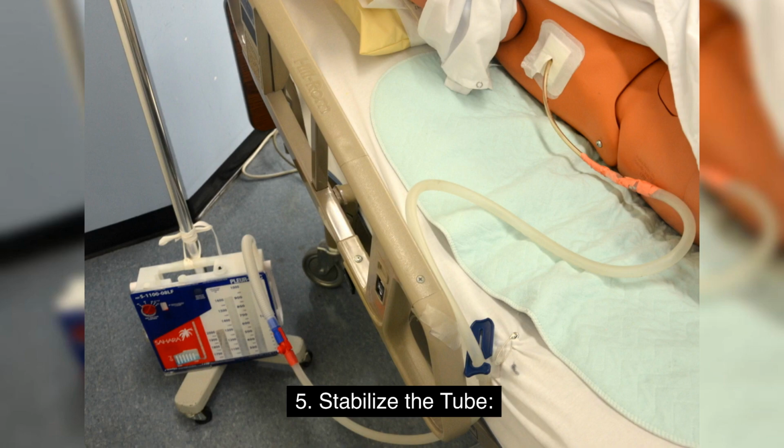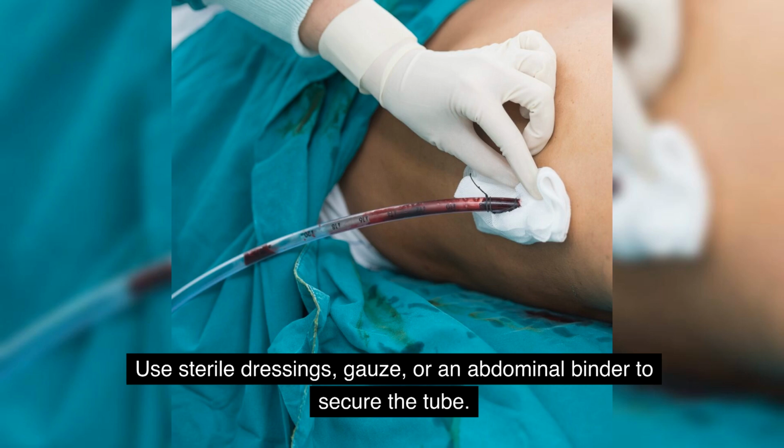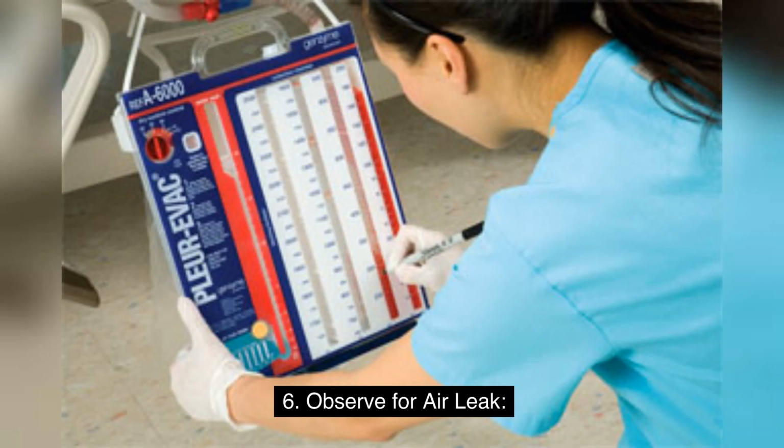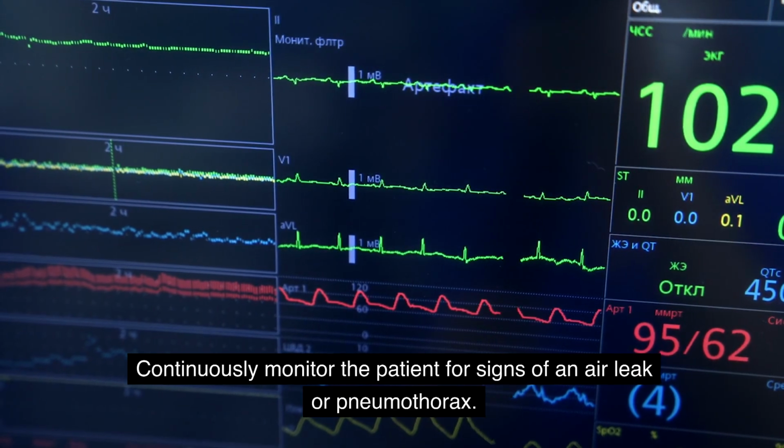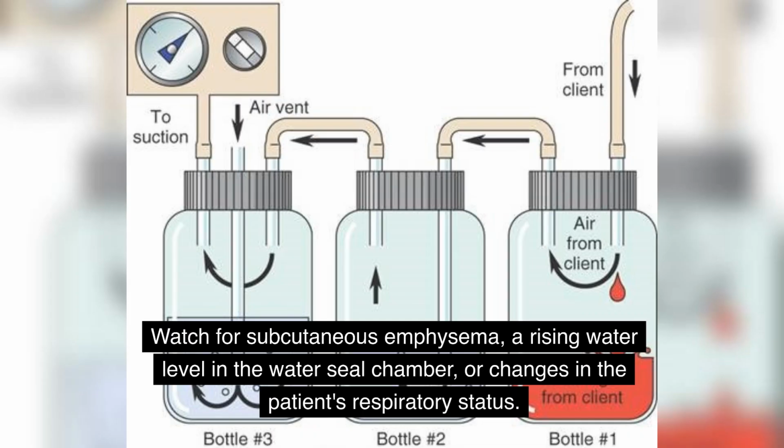5. Stabilize the tube. If the chest tube is still partially in place and not completely removed, gently secure it to prevent further dislodgement or movement. Use sterile dressings, gauze, or an abdominal binder to secure the tube. 6. Observe for air leak. Continuously monitor the patient for signs of an air leak or pneumothorax. Watch for subcutaneous emphysema, a rising water level in the water-sealed chamber, or changes in the patient's respiratory status.